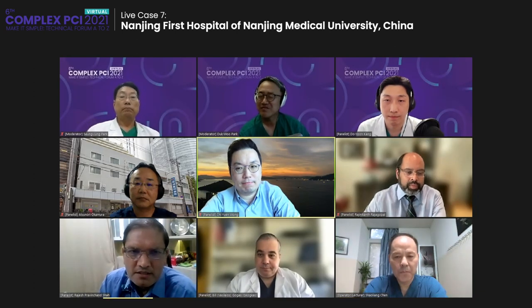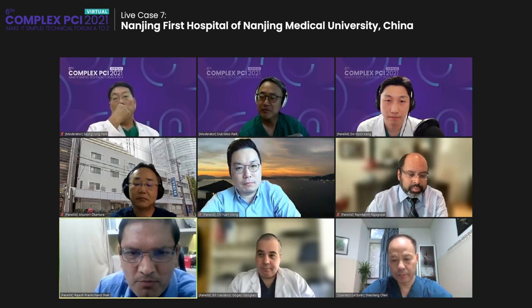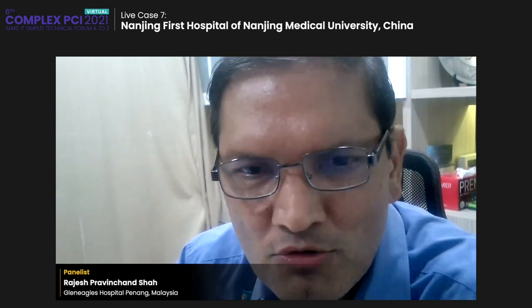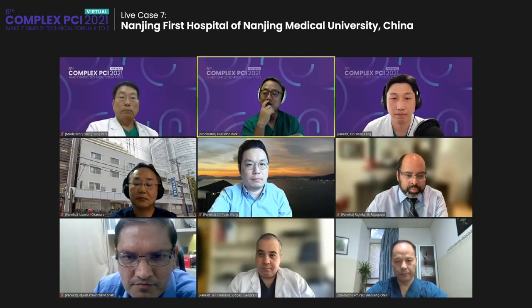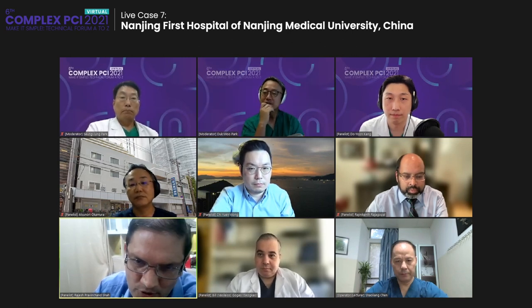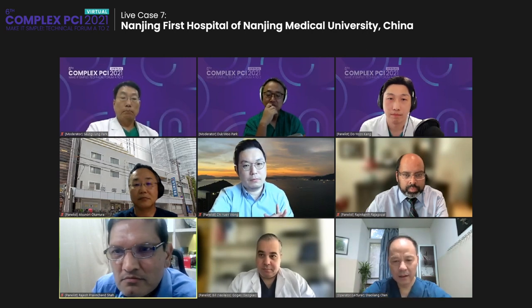Thank you. Okay, how about just using a double lumen microcatheter? Because with that, you get really good support and the wire tends to go in quite easily. Use a Sasuke and just put it there, and the wire tends to go in quite easily, in my opinion. You mean the double lumen catheter for side branch wiring? Yeah, like Sasuke. So if you have calcium, just put the microcatheter in, put it exactly where you want it. You go. I agree, but I could not hear you very well.